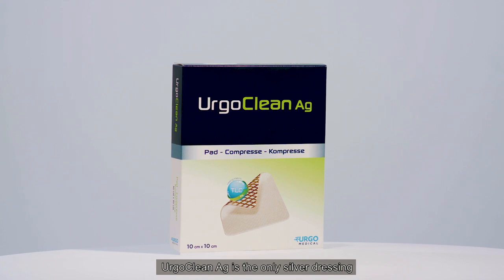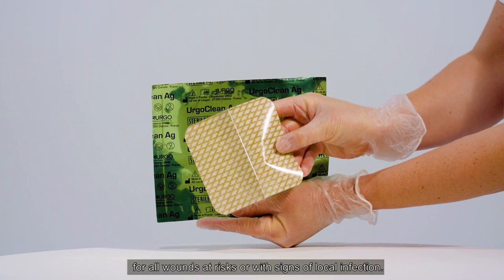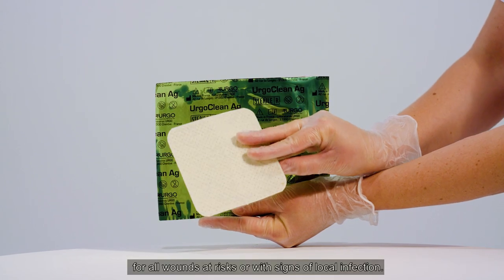UrgoClean Ag is the only silver dressing with complete cleaning action to fight local infection. For all wounds at risk or with signs of local infection.